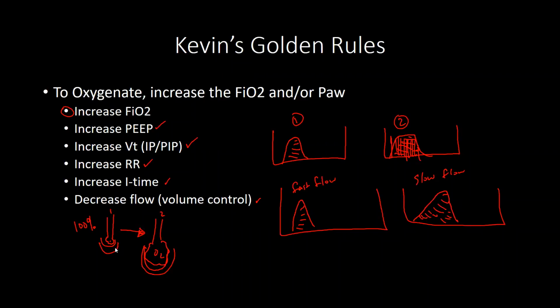But Tamisha, I have homework for you. What I want you to do is write these things down that are on the screen. And then I want you to go to your preceptor and put a lung on a ventilator, just one of those portable lungs that you can put on that expand and whatnot.